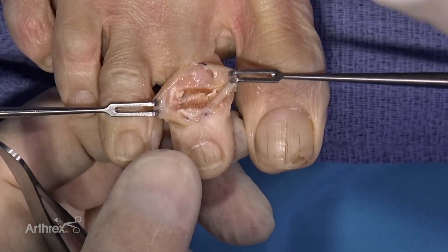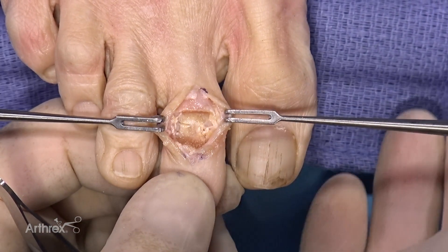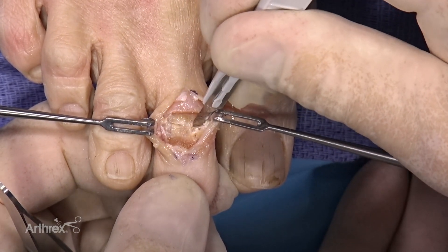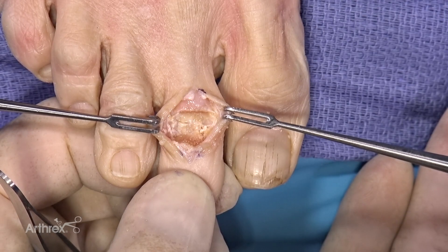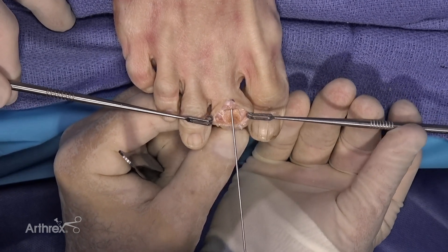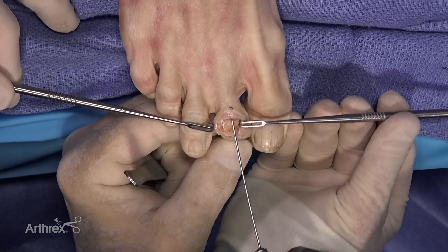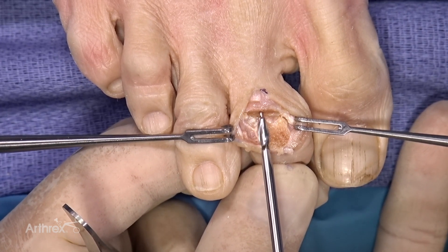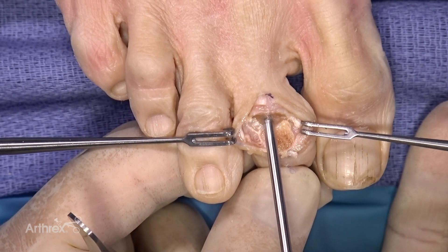One thing that can be problematic when you put the hammer toe device in is that sometimes there's not enough room to reduce it. One little trick: if it doesn't fit, take your blade and cut the plantar capsule — not the flexor tendon, but the plantar capsule — and that will give you another millimeter or two to allow you to reduce the implant. We're going to place our 0.045 K-wire right down the intramedullary canal of the proximal phalanx, letting it run so it stays in the right location, not going into the MTP joint.